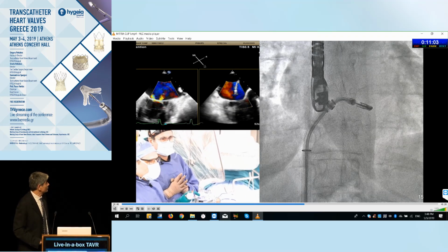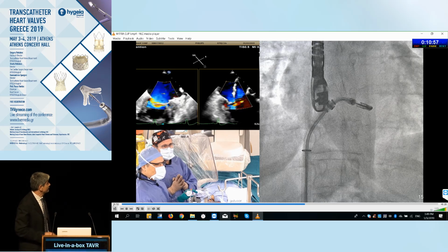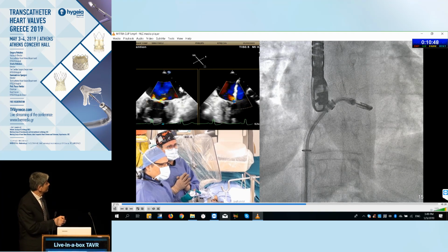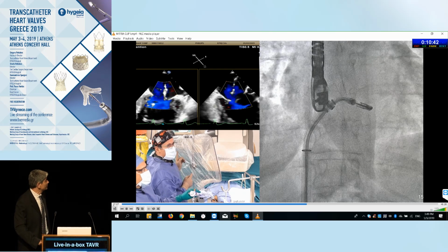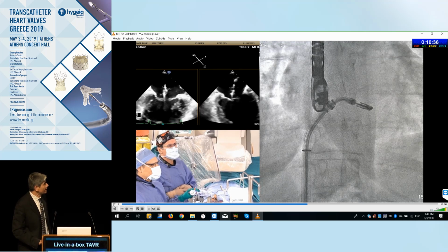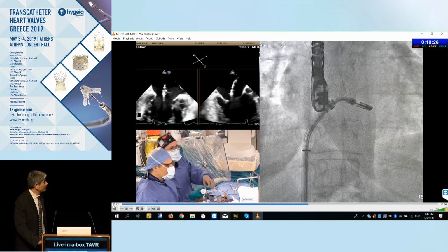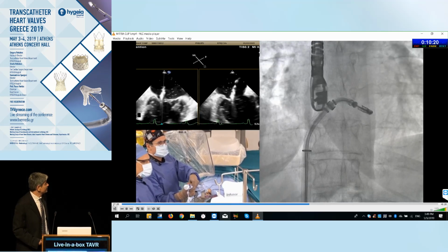The patient is now sedated, so it doesn't appear that much, but with the patient not sedated, we had significant mitral regurgitation. The trajectory here is central, mediolateral, we're on the center. We're facing a bit posterior, but overall, it's a good place to start. Our plan was to implant a clip right at the center of the valve, maybe slightly more medial, and see how that affects the degree of mitral regurgitation, with a plan that if there was significant MR from both sides, we would implant a second device.